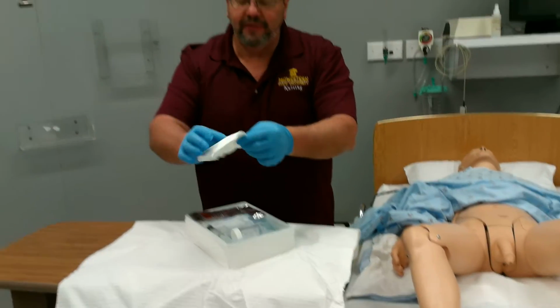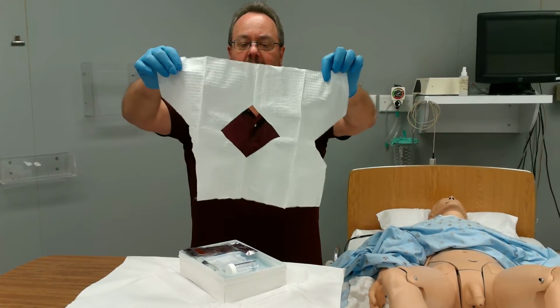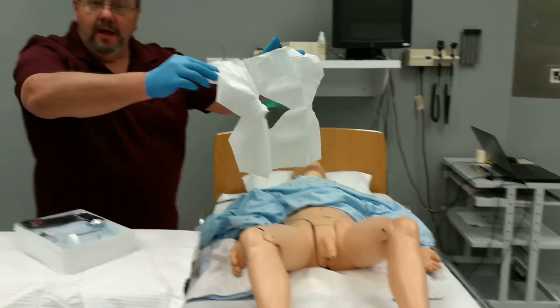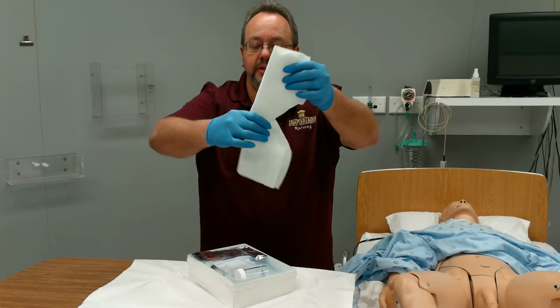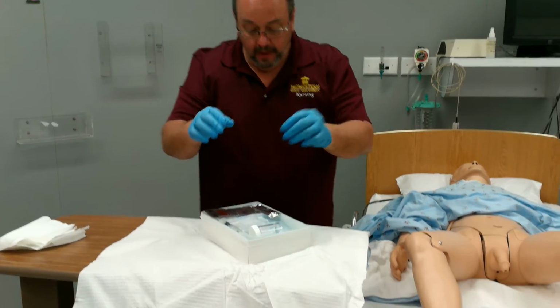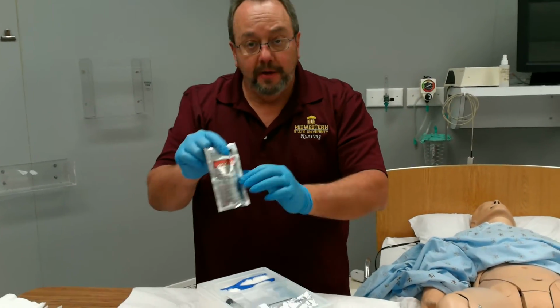This is called a fenestrated drape, and it is a drape that you can put over the genitals for another sterile barrier. This is an optional drape, so you can opt out of using this. And I think I will opt out. Then this has lube in it. It has my betadine soap in it.